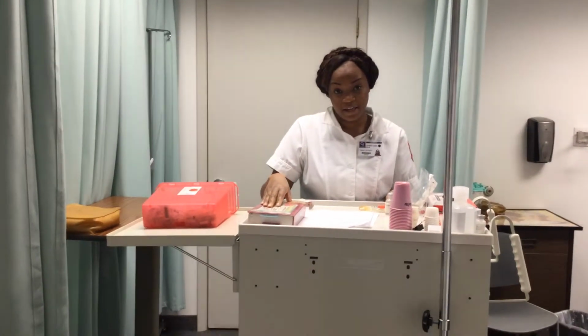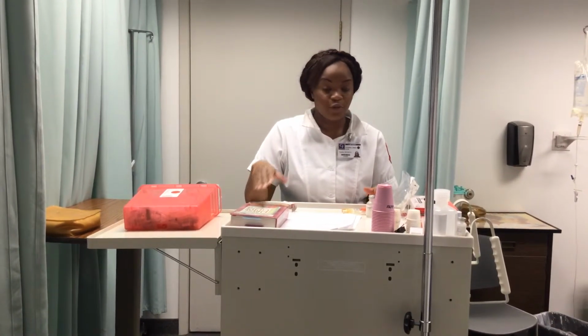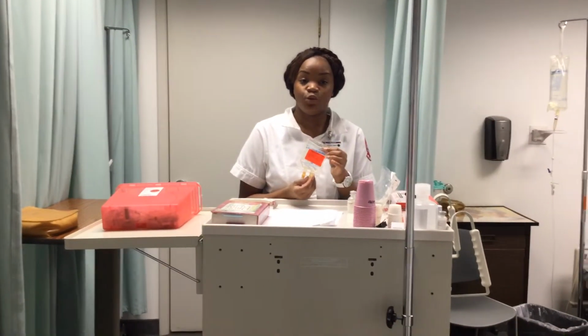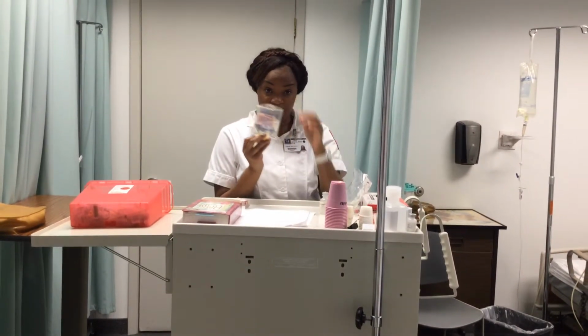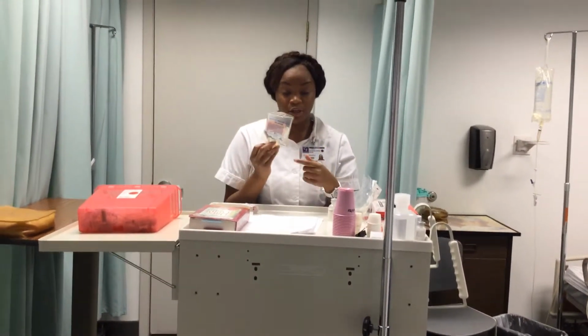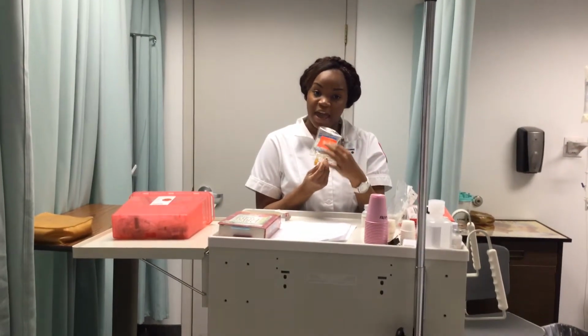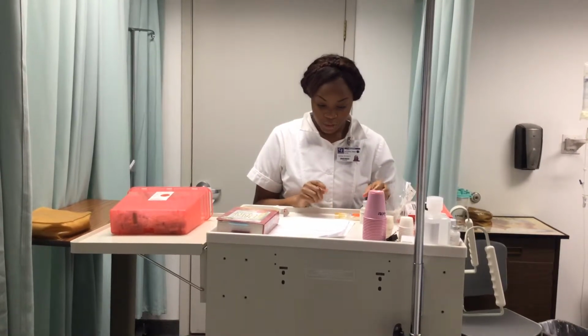Gentamicin is an antibiotic, and it's normally given at a concentration of 10 milligrams per ml. Further research has shown that gentamicin is normally diluted in normal saline between 50 to 100 mLs. I have a 50 ml bag of normal saline that I will be diluting the medication in. I also have already pre-labeled the package with the gentamicin on it, so once I get into the patient's room.